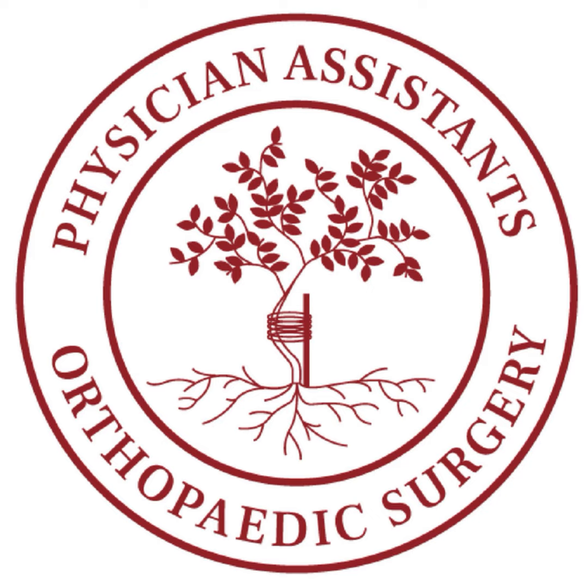Yeah, so the ankle joint, I think this is some of the things we've learned over the years on how to make the implants more successful. The talus is very small compared to, say, the knee or the hip. It's got a much smaller surface area than the hip or the knee, but it bears the same amount of weight and the same amount of stress when somebody walks or runs or jumps or hikes, whatever it is. So we've got to take that into consideration.